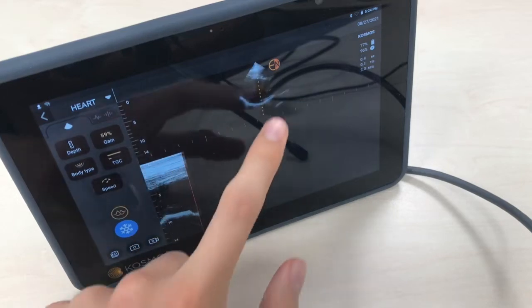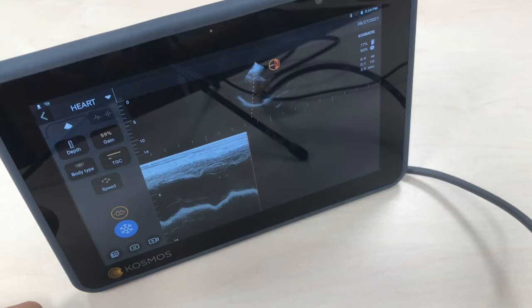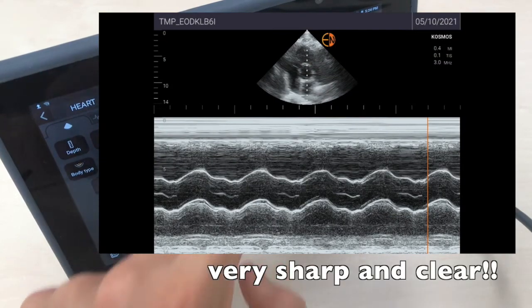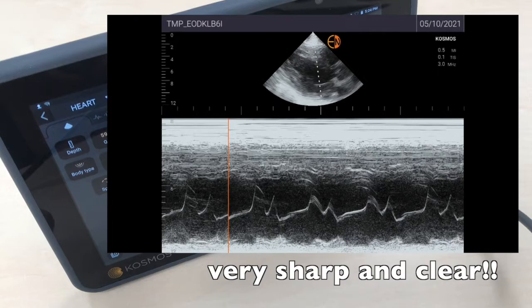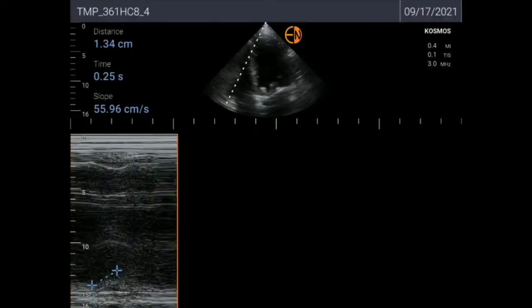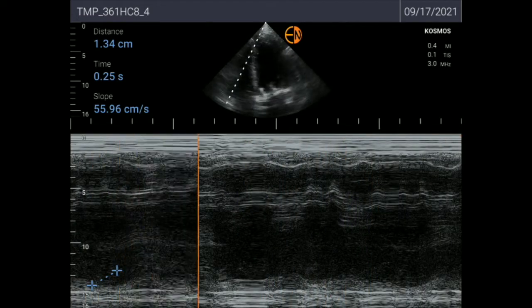We're going to try the M-mode and as you can see it's updating live — the M-mode is really good. Here you're seeing it at the aortic valve level, and here at the mitral valve at the parasternal long axis. And here you can see a TAPSE measurement, which is an estimate of right ventricle contractility.